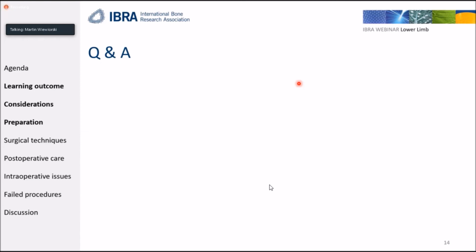So I think this is an important landmark for you during surgery, because the goal of any hallux valgus surgery, whatever bony procedure you do, is to place the metatarsal head back on top of the sesamoids, and not the other way around, release the sesamoids all the way so they can force under the head. I personally don't believe there's a shortening of the intermetatarsal ligament that connects the sesamoid to the second metatarsal. I think the sesamoids are your reference of the original position before the hallux valgus deformity.